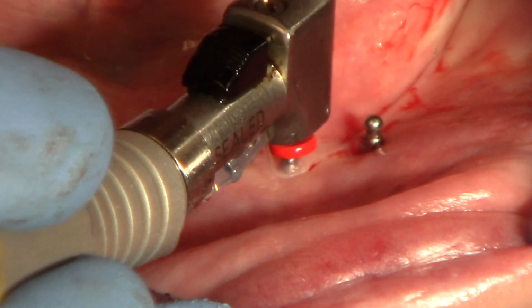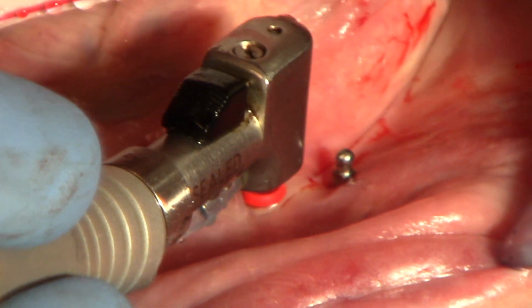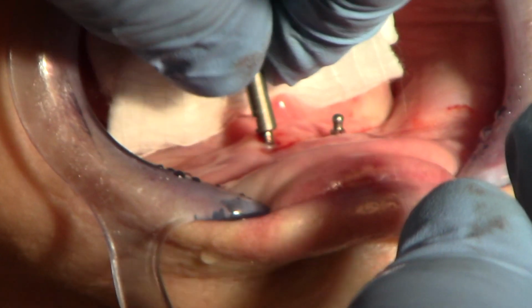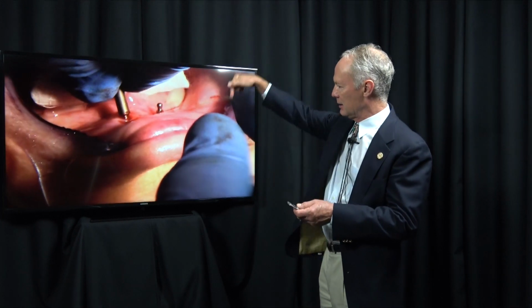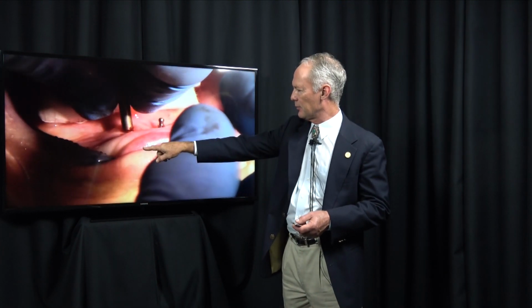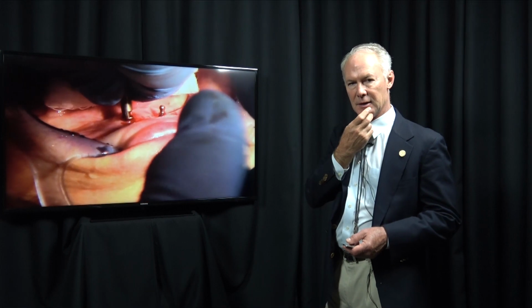Okay, so I'm trying to engage the cortical bone at the apical part of the mandible. That is the reason I'm drilling further. Now I'm not worried about the pilot drill extending deeply into the bone in the anterior region because I know where my mental nerves are, the mental foramen, and there's not any innervation in this part of the mandible.